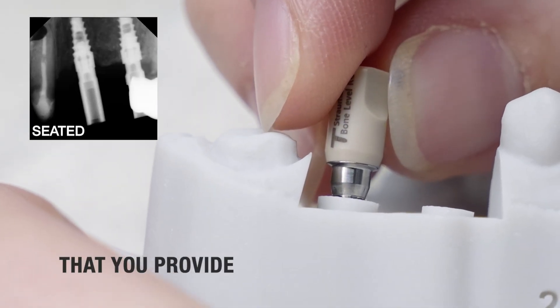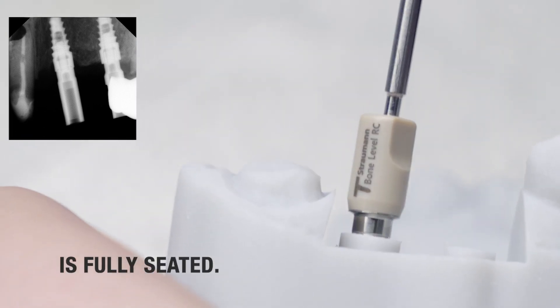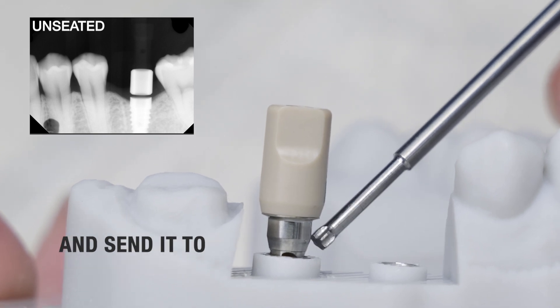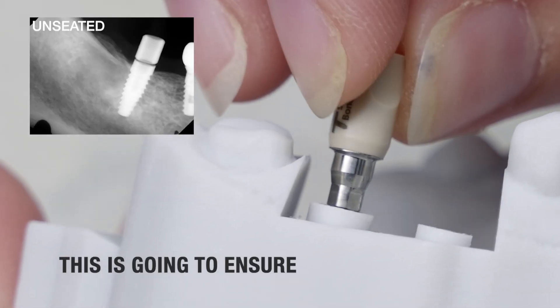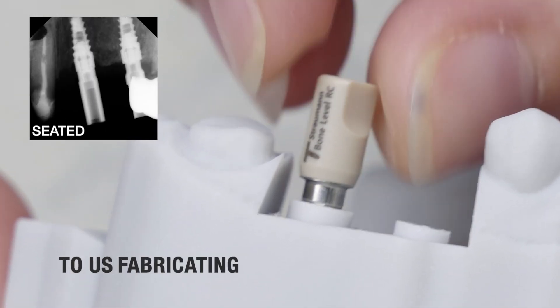The second scan that you provide is going to be that of the scan body. It's important to make sure that the scan body is fully seated. Always provide an x-ray of some kind and send it to the laboratory. This is going to ensure the scan body is seated because that component is so critical to us fabricating an analog model that's going to replicate your patient's mouth.